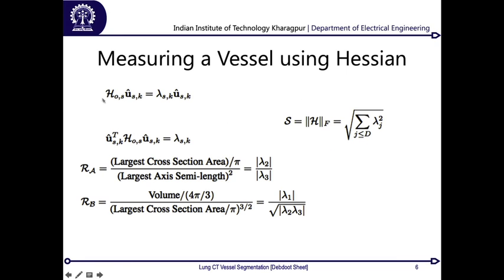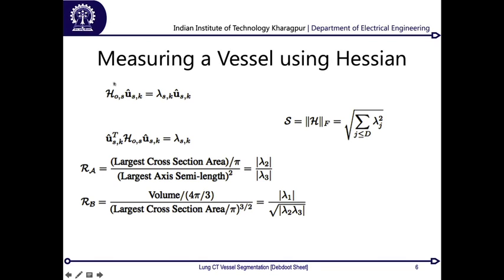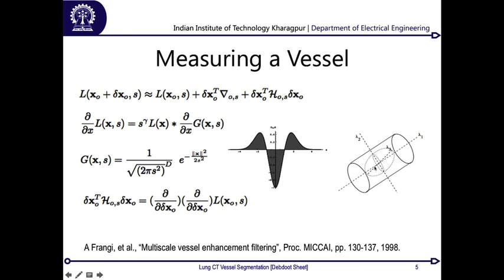Okay. So this is a concept which we use from here, and then we extend onto that concept. What we do is run an eigenvalue decomposition, or say a principal component analysis, on the Hessian response on the image, such that the Hessian response is equal to some sort of lambda times, where these lambdas are the principal component magnitudes, times these principal component vectors. You can get that by just doing a principal component analysis. Now we are not interested so much in the vectors, which would basically be aligned along these directions.